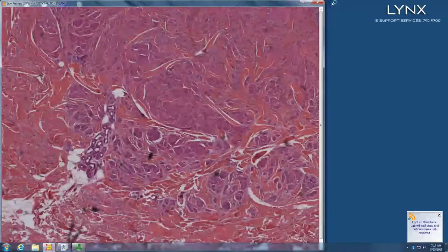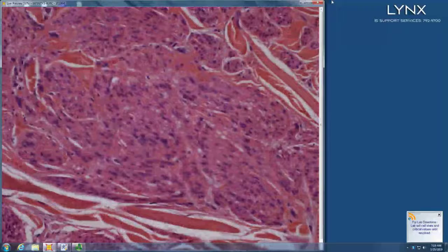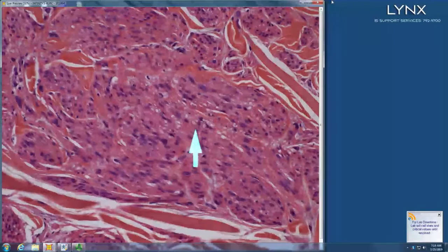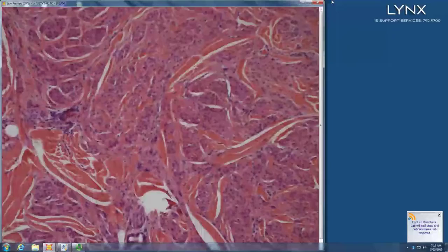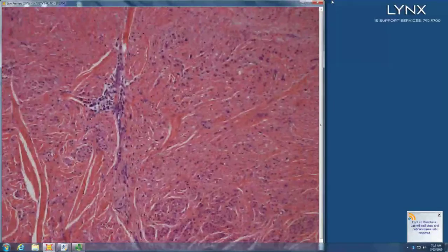So, it has fascicles similar to a palisaded encapsulated neuroma, but what's the differentiation of the cells? They have little glycogen vacuoles, little snacks that they're carrying, cigar-shaped nuclei and fascicles. So, smooth muscle differentiation.